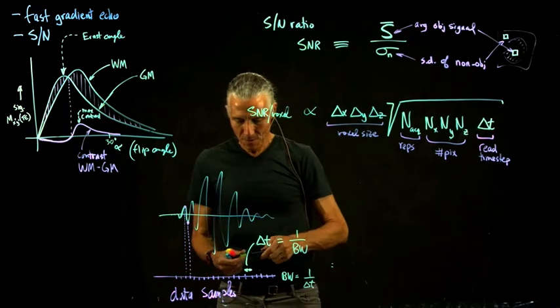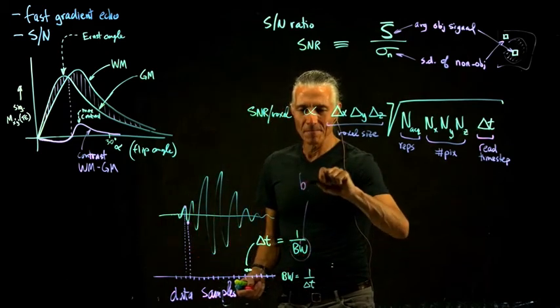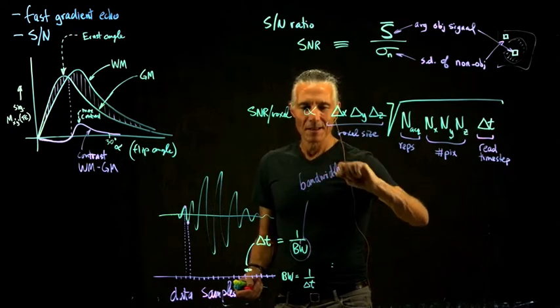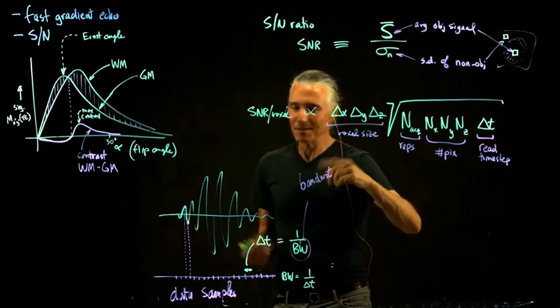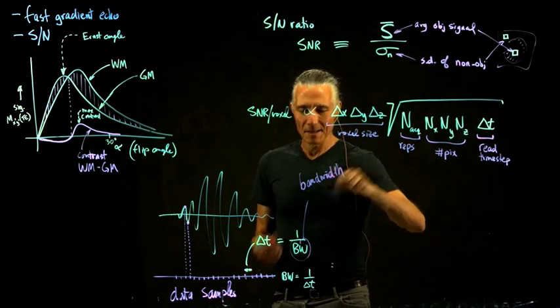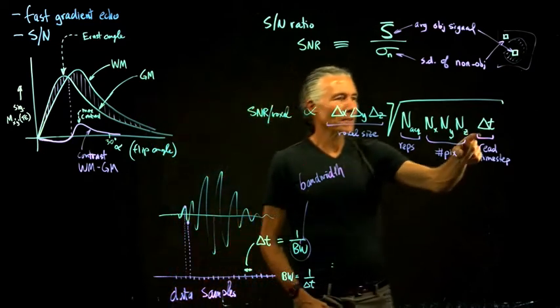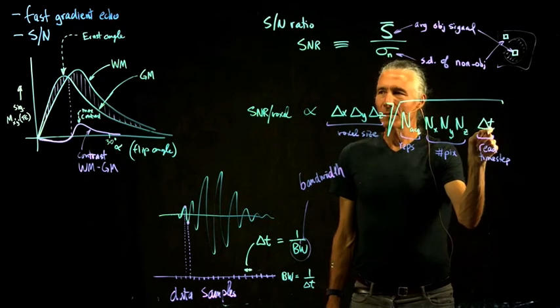So what does the bandwidth mean? When I talk to the physicist, he said it's just that a lower bandwidth is going to have higher signal to noise. They just knew that. So if we make this smaller, we get less signal to noise.